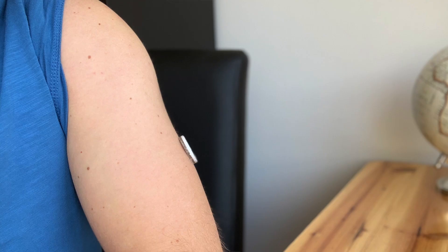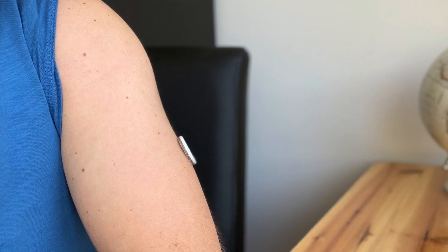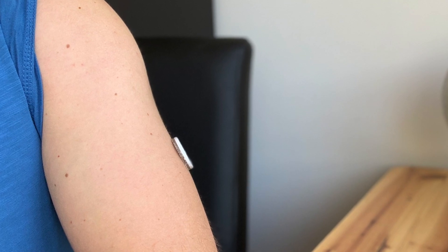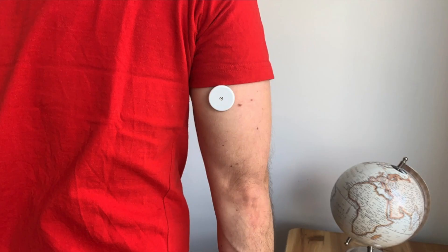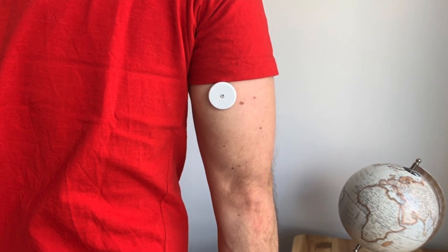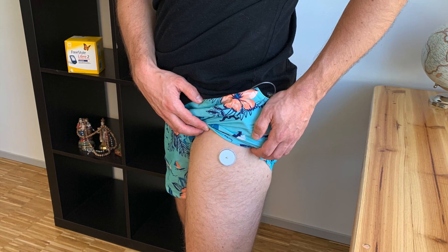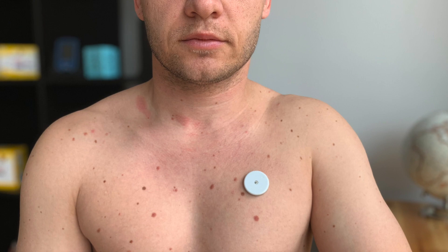Mistake number two: you apply your Libre in the wrong spot and your sensor gets ripped out. A lot of users place their sensor on the outer side of their arm and are surprised when the sensor gets knocked off by a door frame, seat belt, backpack or something else. The outer side of the arm is more exposed. I actually stopped using the outer side for that reason — I find the back side slightly towards the inner side of the arm much safer. I also started experimenting with alternative sites for sensor placement: I tried thigh and chest, which are so much less exposed than the arm, and I made a video about each of these alternative sites.